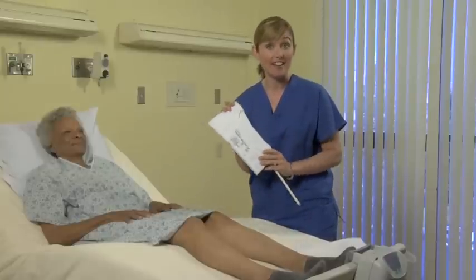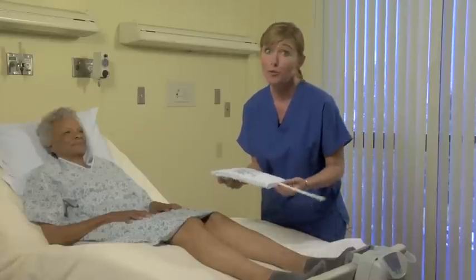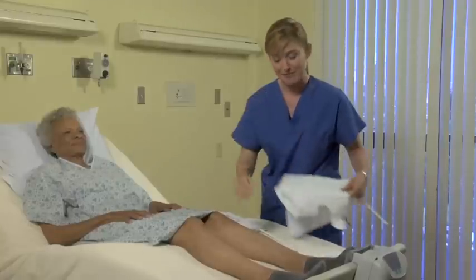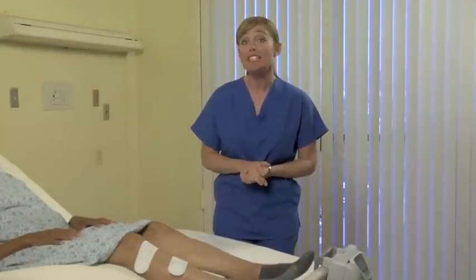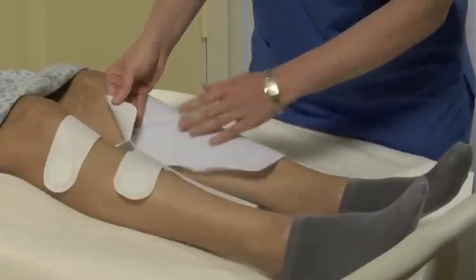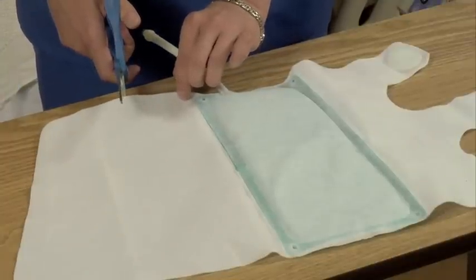The next step is applying the cuffs. Apply the cuffs with the tubing pointed towards the foot. The cuffs are hypoallergenic and may be placed directly against the skin or over a light compression stocking. The performance of this device is consistent no matter where the air cell is placed. You may place the cuff in a posterior, anterior, or lateral position. In the operating room, it's advised to place the air cell in an anterior position to minimize movement during the surgical procedure. Wrap the cuff around the leg and secure the cuff straps so that they're snug but not tight. The cuffs are one size fits all and may be trimmed for a more snug fit.